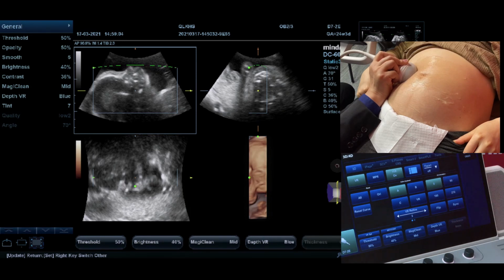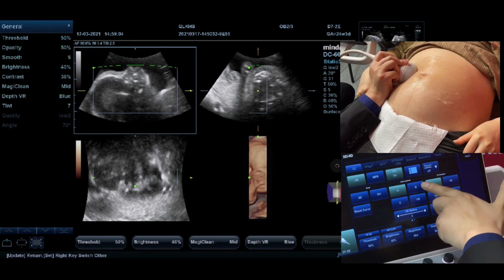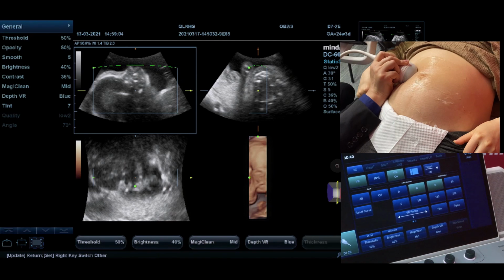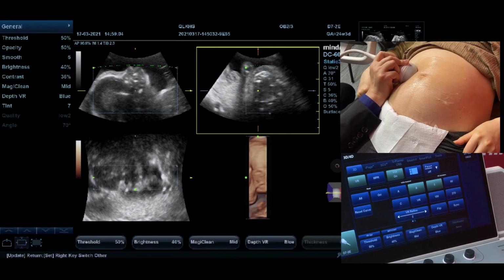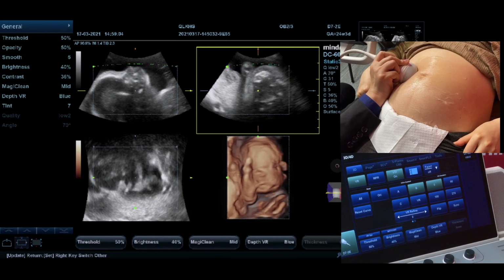First, you can see here, the B plane. This ROI box is too small. I will change it to B and then set, change the ROI box. You can see here it will show you all the information.